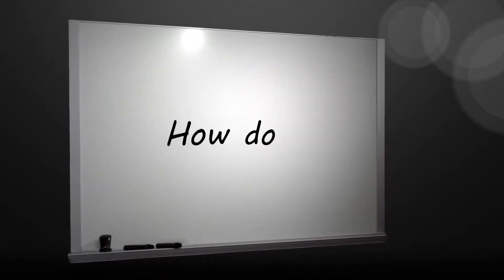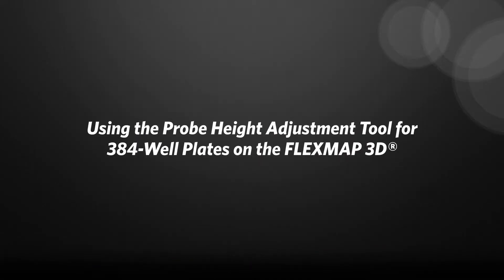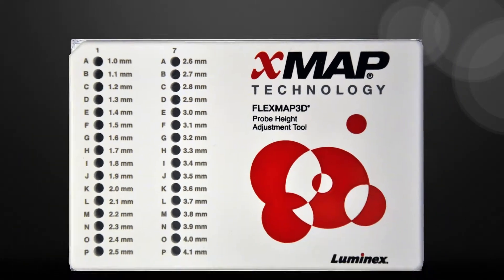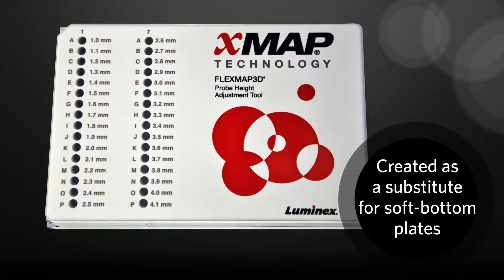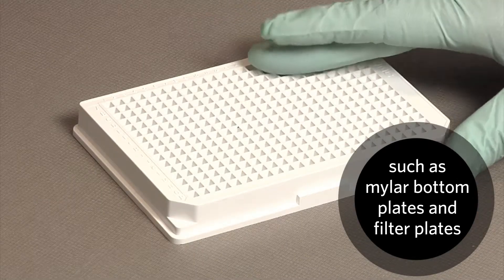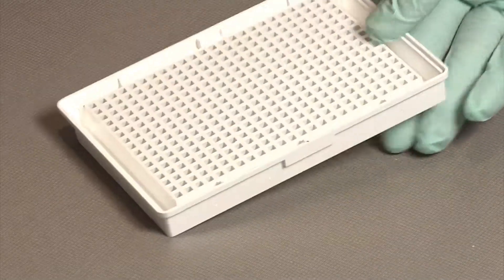How do I use the probe height adjustment tool for 384 well plates on the FlexMap 3D? The FlexMap 3D probe height adjustment tool was created as a substitute to adjust the sample probe height for soft bottom 384 well plates, such as mylar bottom plates and filter plates.